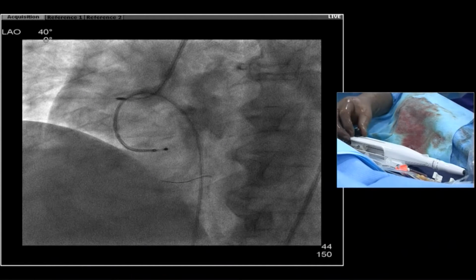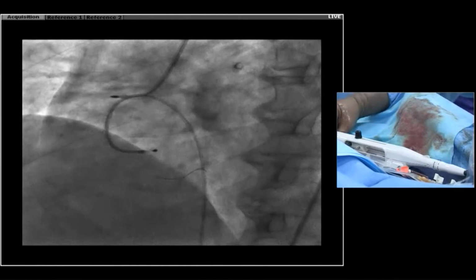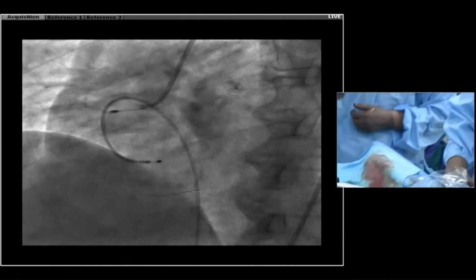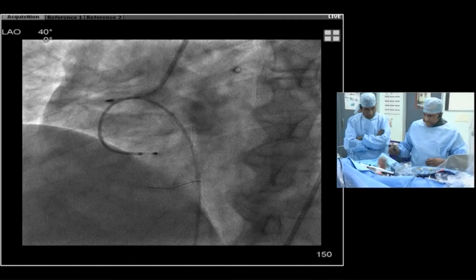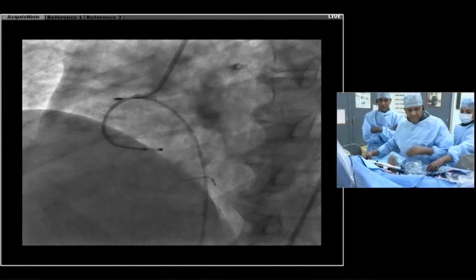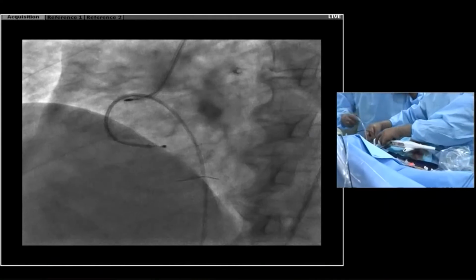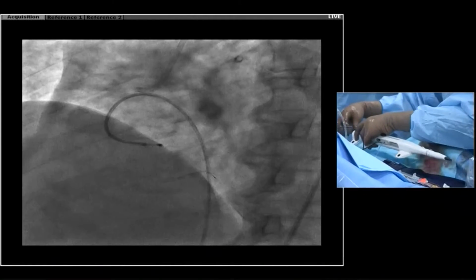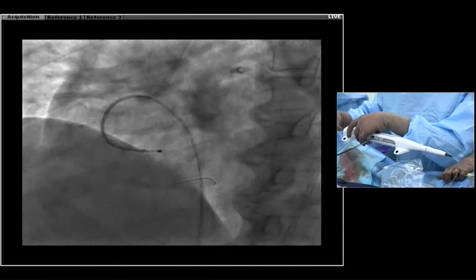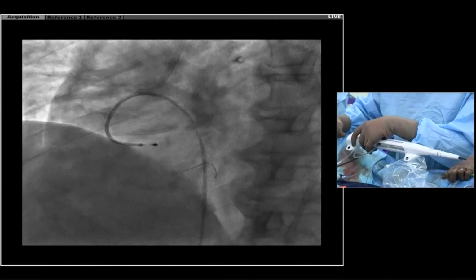Five weeks back, I had a gentleman with a similar right coronary artery as now shown from Mumbai, and it was really asystole. We stopped the procedure. It was necessary to put in a pacemaker to continue the rota case. And from more than 300 cases, this was only one case where we definitely needed a pacemaker.